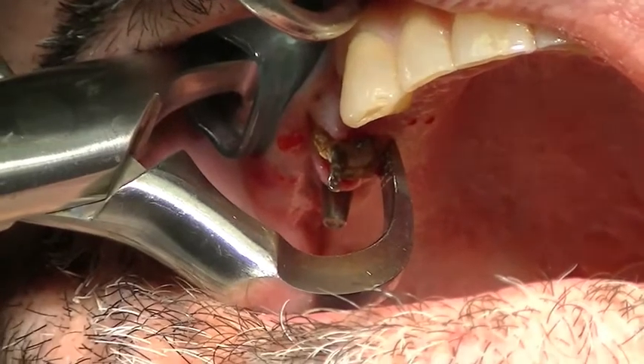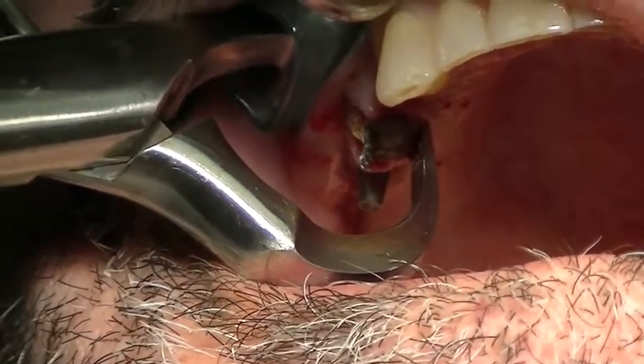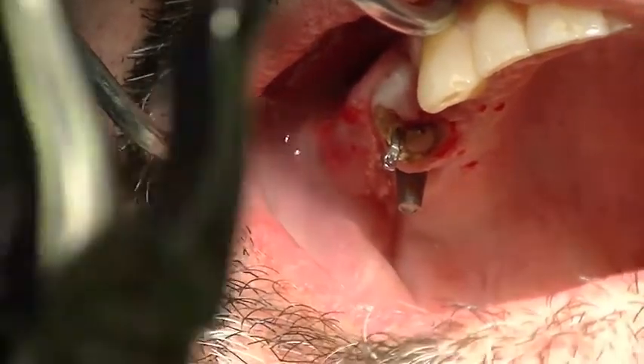I am now rotating my wrist, not my forearm, not squeezing the instrument, towards the corner of the patient's right eye, creating tension onto the palatal surface. And after a few moments, the tooth disengages, or moves a millimeter or two.